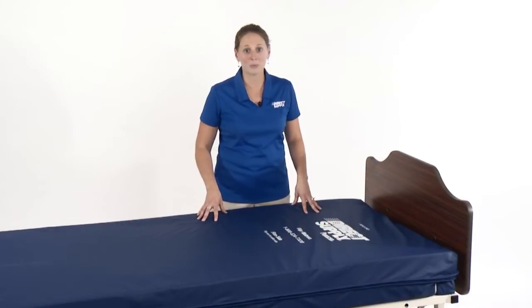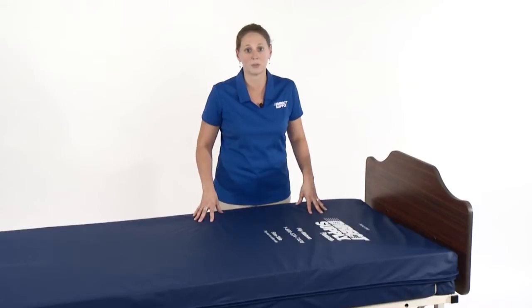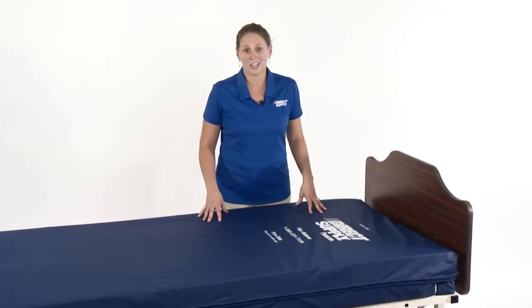As with all of our foam mattresses, we strive to bring you the most comfortable mattresses with great pressure redistribution qualities, because we know that better sleep equals better overall health for your residents. We also know that not everyone has the same idea of what's comfortable, but it's unlikely that a building has enough space to store mattresses with different firmnesses for every resident.